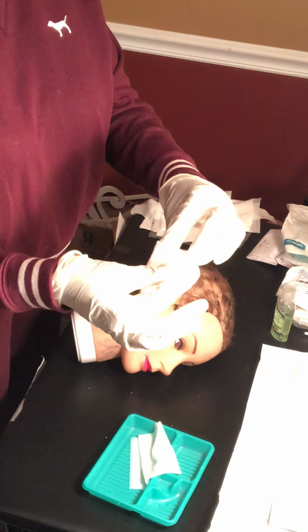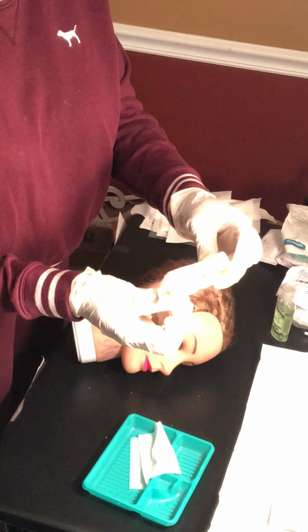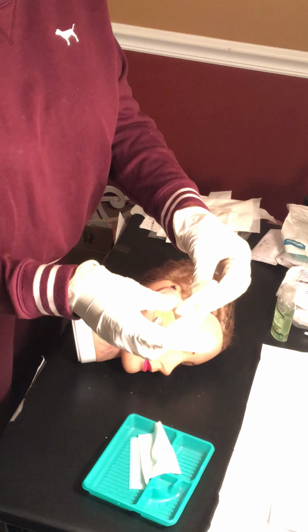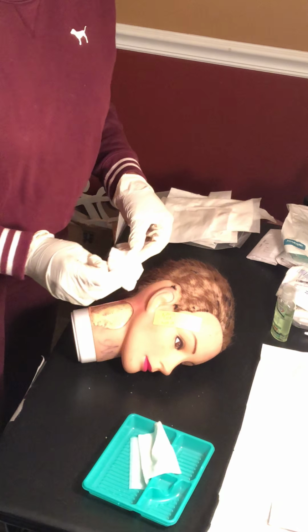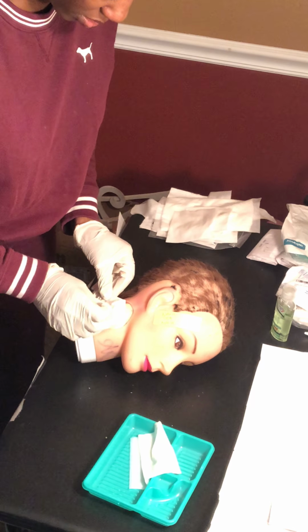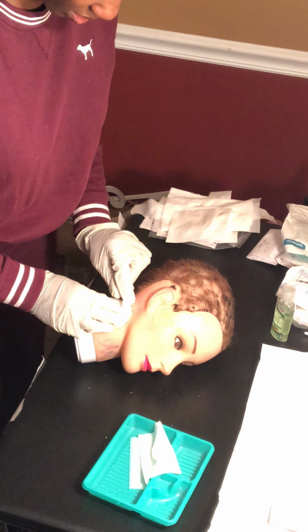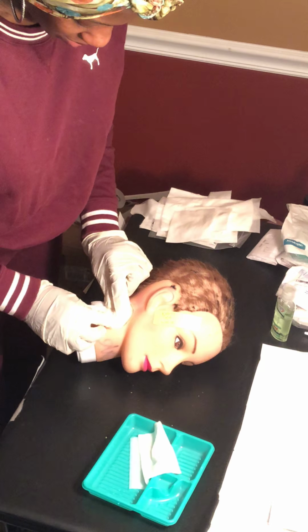So when you initially get in there, you want to make sure it doesn't go beyond the borders of the wound, because if it does, you're in trouble. So I got it kind of small there. And then I'll sit it in there. Make sure it doesn't go over any of the borders. And then put it in there gently.